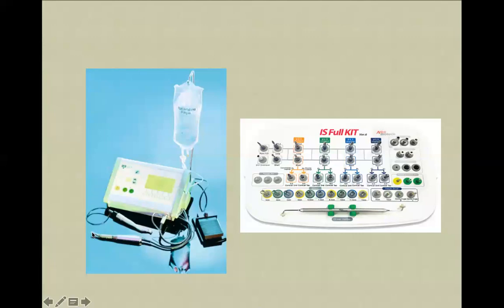This is an electrical handpiece. Usually this cable could be sterilized, but usually we're covering that by means of special sheets. Of course, the handpiece itself should be sterilized, and it is provided by a special pump.